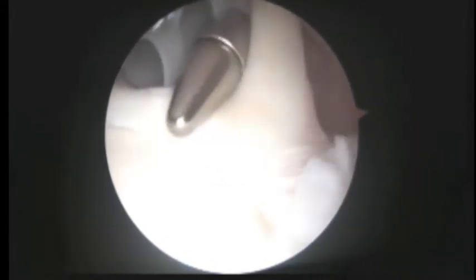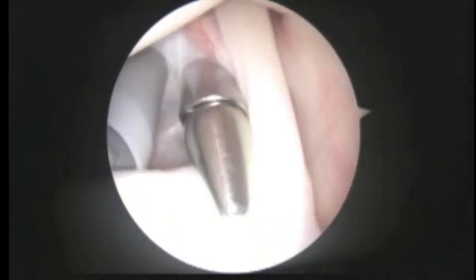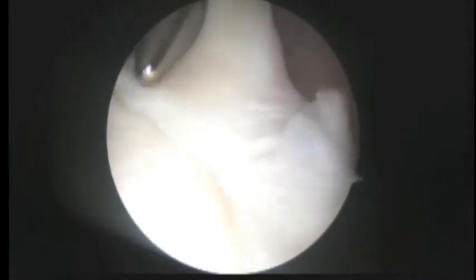And right off the bat, you can see we've got two cannulas coming in the front of the shoulder. We've got your biceps tendon off to the right side of this metal cannula. The tendon itself looks fine, but we were worried about this biceps anchor, and sure enough, we can see how it's detached. So we're going to work on that as well today.